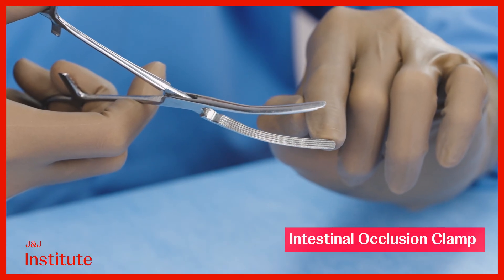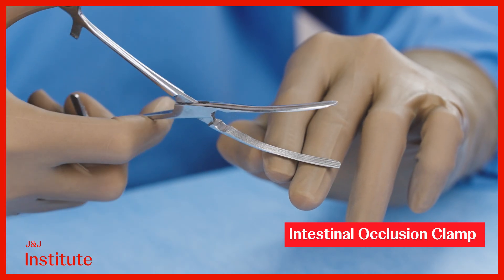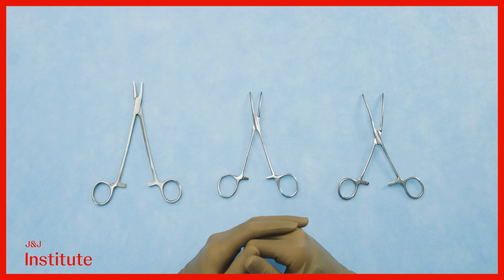This is an intestinal occlusion clamp with atraumatic longitudinal milling across the very long jaw. Observe the difference in proportions between these instruments.